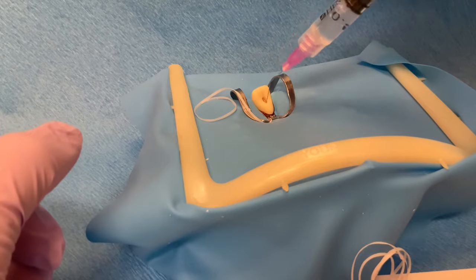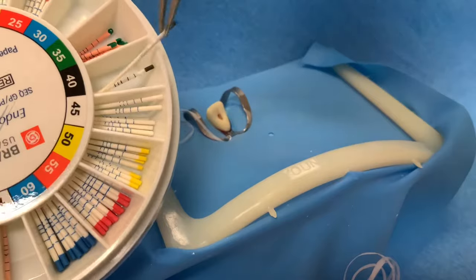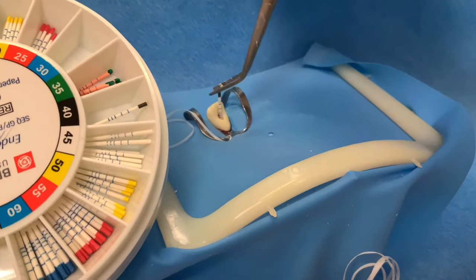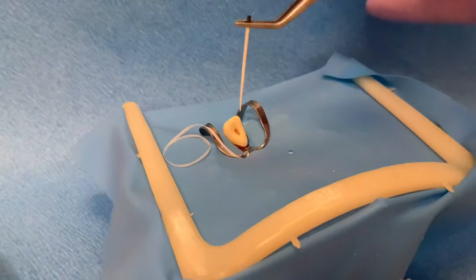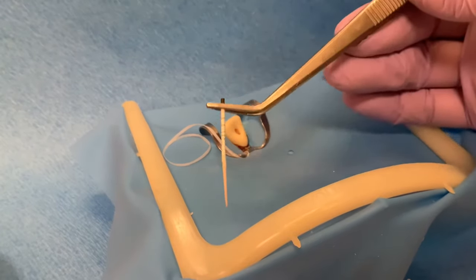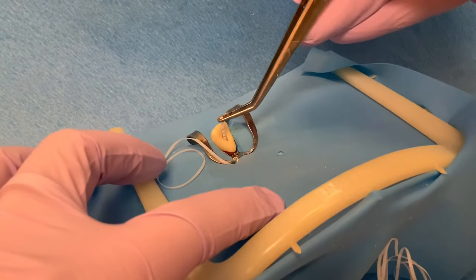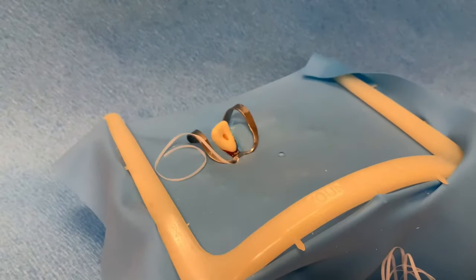Irrigate one last time and then dry the canal using paper points, preferably the same size as the master apical file. Insert one paper point at a time until it comes out completely dry. This one is not dry so we may have to use a few more. This paper point is dry; now we can place the master cone with sealer.